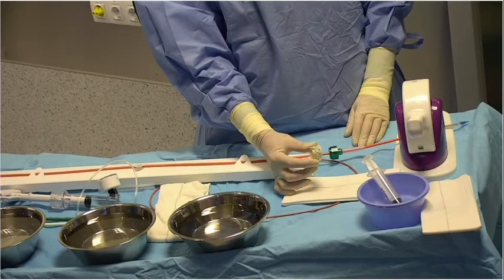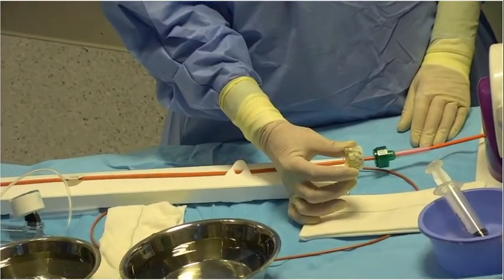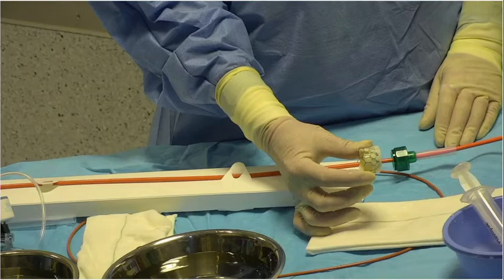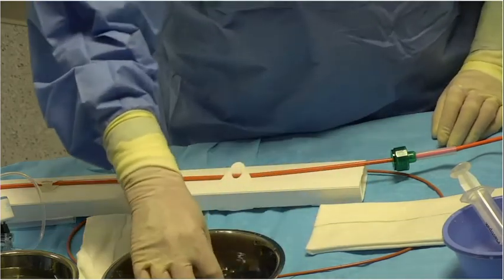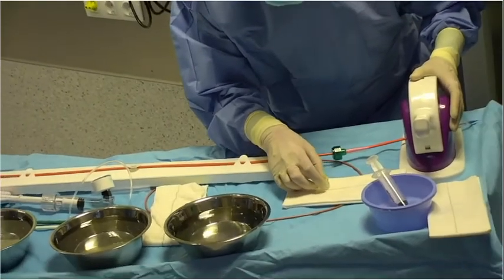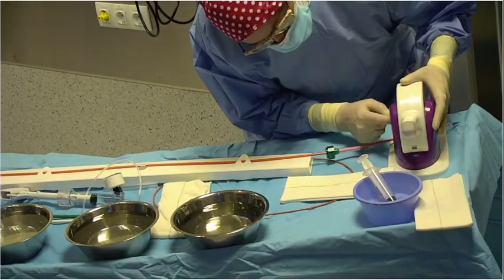So now Belen is going to crimp it with one of the commissures pointing down, like at 6 o'clock, for this commissural alignment thing that we mentioned. So, okay, Belen, you can start the crimping. So the crimping is quite quick. So we are going to wait for her to crimp, and then we do the predilation with the mammoth balloon.